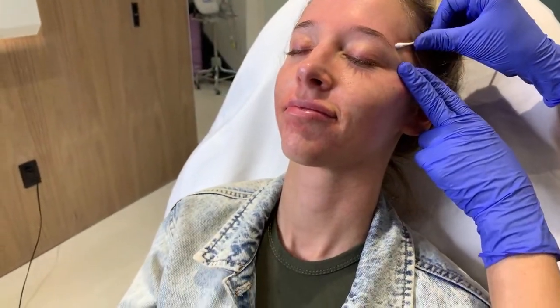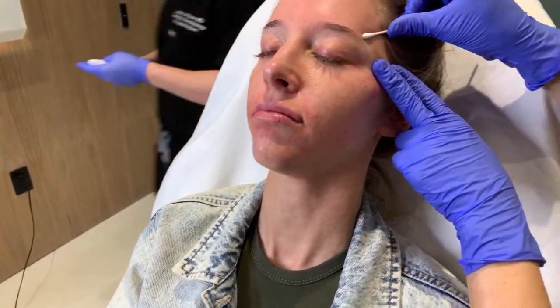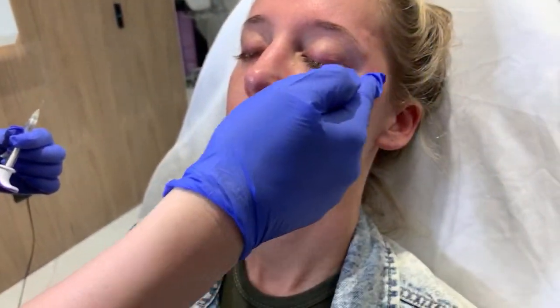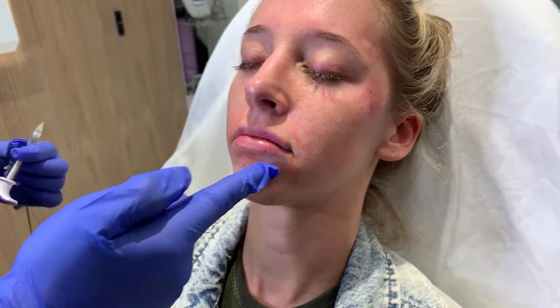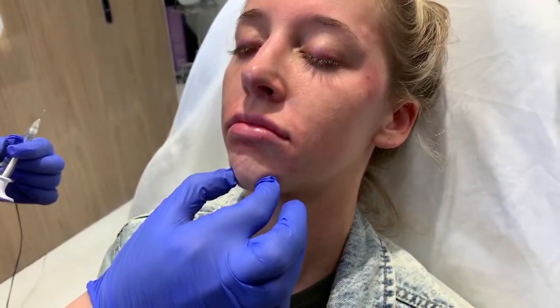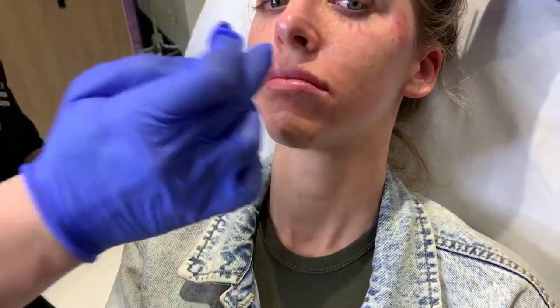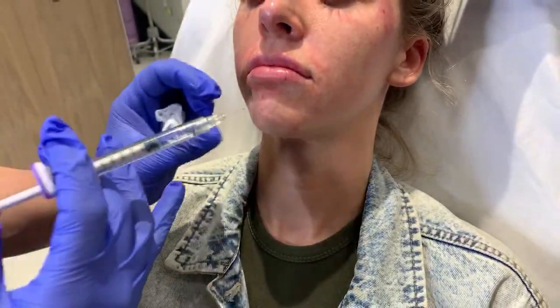I do. Okay. I'm gonna do two pokes in there because it's gonna blend. So with her, if we look at this angle here, we draw a line from here to the corner, right to the middle. You wanna keep her chin very narrow, actually. If you look from the side, now that her lips are elongated, we just need to project.